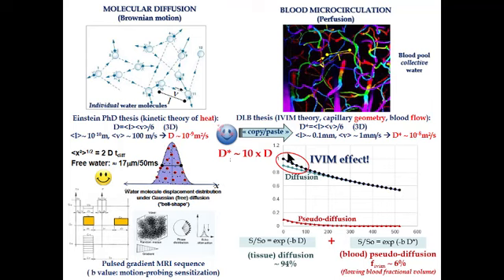So the IVIM effect is seen only at low b values as a deviation from what we have from pure diffusion. So basically, it's very easy to write the signal weighting. We have the diffusion part, and we have the IVIM perfusion part with the correct weight.